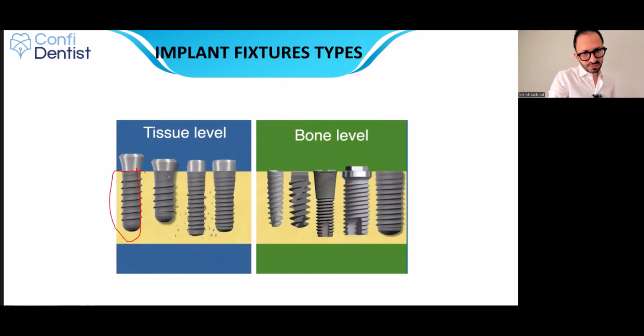So this part is very porous. It has the porosity, and it also has this macrostructure. This macrostructure not only helps with increasing the surface, but helps with anchoring the implant inside the bone. Okay, so it's like it screws into the bone. It helps with the initial stability.